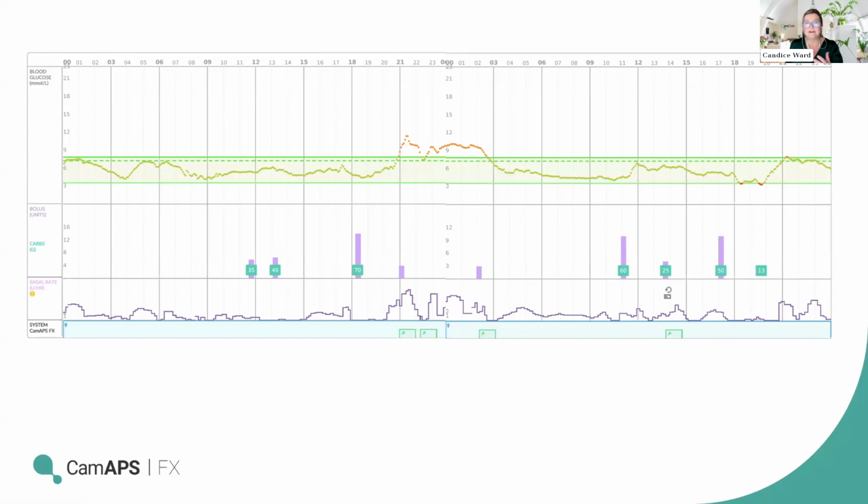She's gone over that, there's quite a big bolus, quite a lot of carbohydrate, and maybe the ratio is right if it was 50 grams of carbs rather than 70 grams. And she maybe could have split that into two meals, if that is possible. Or is it actually that we've gone a bit aggressive on that insulin to carb ratio throughout the day?